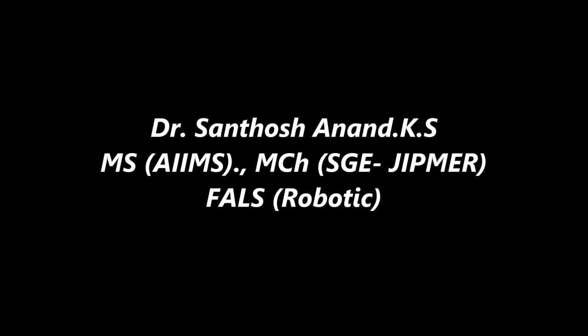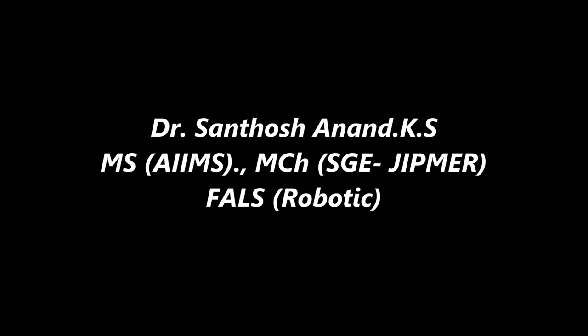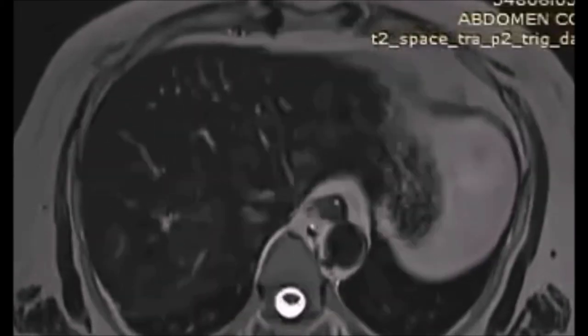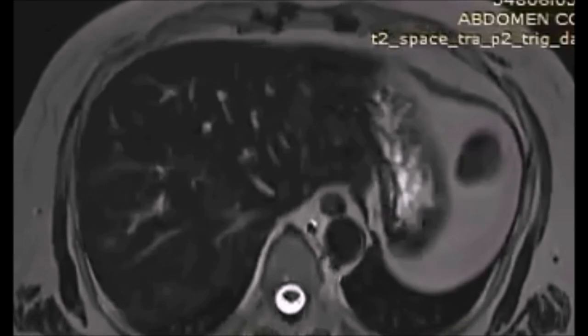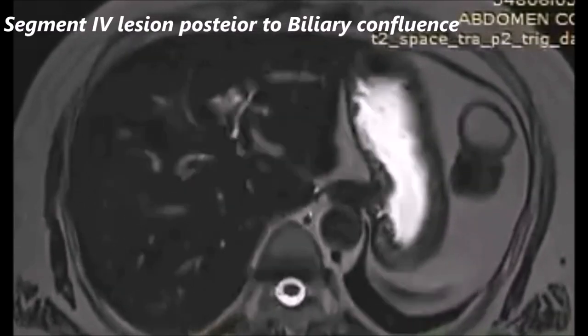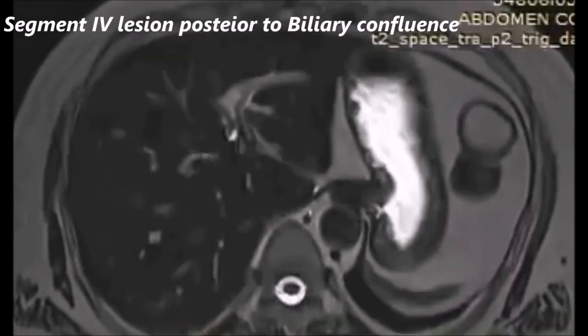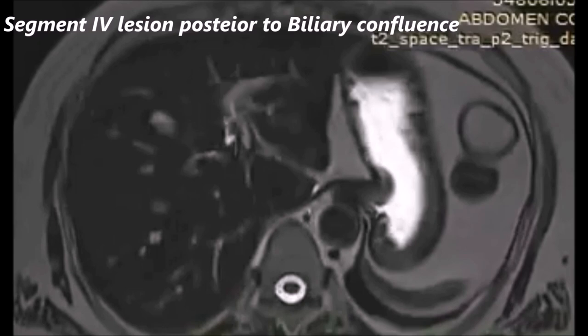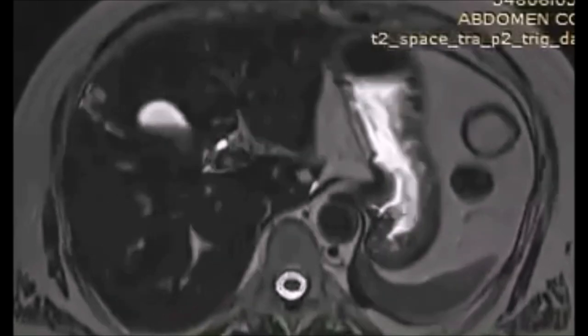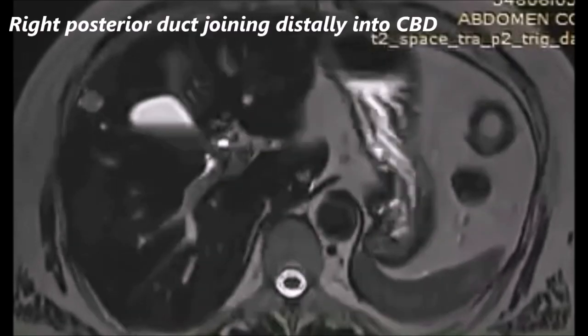A 72-year-old gentleman with CAC presented with intussusception and underwent laparoscopic right hemicolectomy. He had synchronous liver metastases also, and received 6 cycles of Folfox, showing partial response. The tumor was predominantly on the left lobe, with one small lesion in segment 5 close to segment 4. He underwent left hepatectomy with caudate lobectomy.